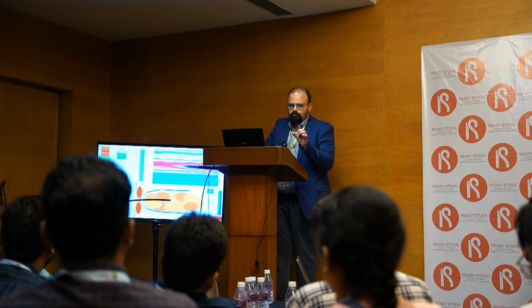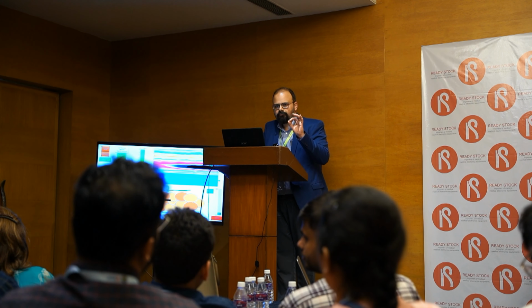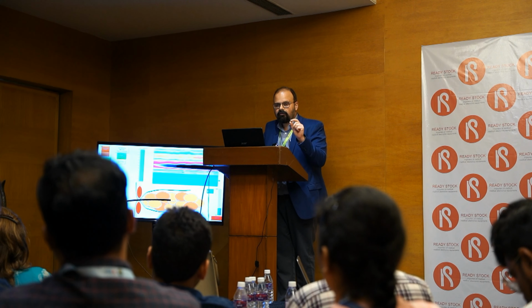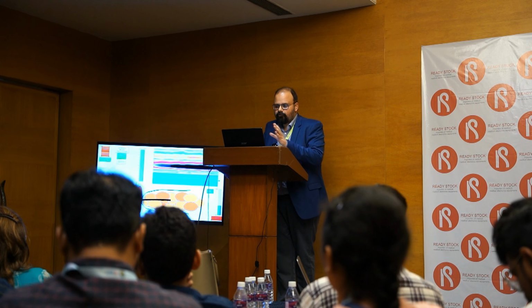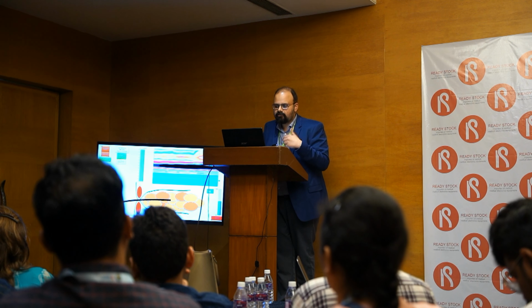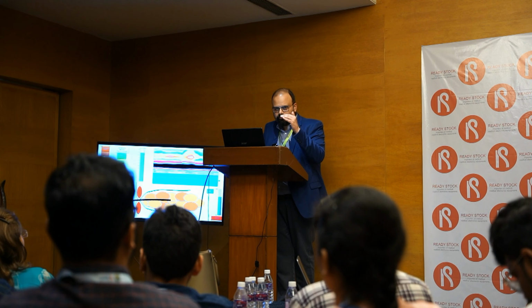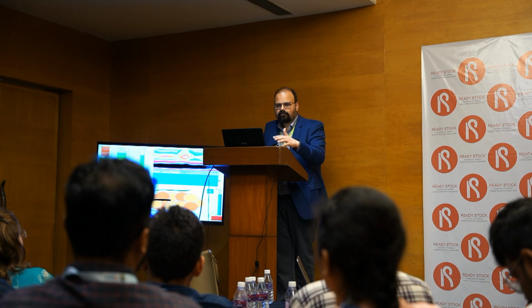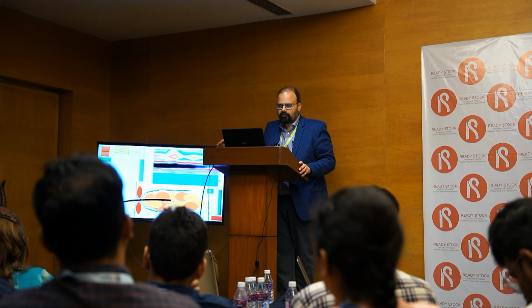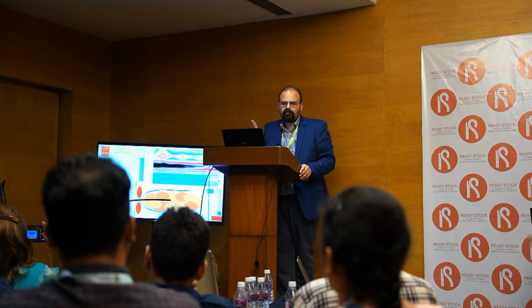So when you are starting with the squeeze, I usually see on my rectal manometry what the squeeze pressures are. If they are around, let's say 180, and I set the pressure to 120, it will not be of any use to that patient. So I will increase them to almost 200, 220, 240. Then they will have to learn to squeeze hard and relax. I want to fatigue those muscles during my first few sessions. So this pressure I usually keep higher than what they have achieved during their manometry itself.